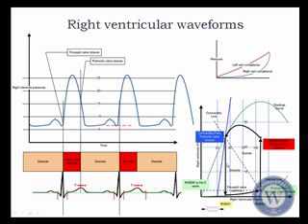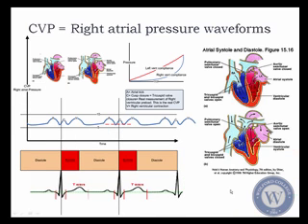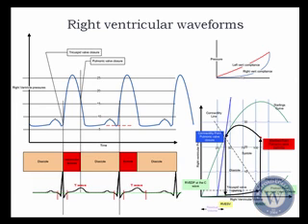The pressure over time curve is consistent with the right ventricular waveform. So when we were talking before about CVP, you noticed that I didn't have in this drawing the actual pressure volume curves. The reason I didn't have a pressure volume curve on this is because pressure volume curves only apply to ventricles. Okay, so when we're looking at this graph again, now we're looking at a ventricle. In this case, we're looking at the right ventricle, not the left. So when you change that, you change the parameters in the sense of pressures.